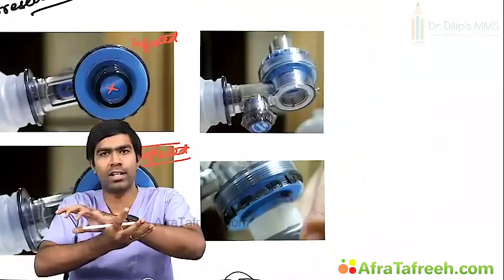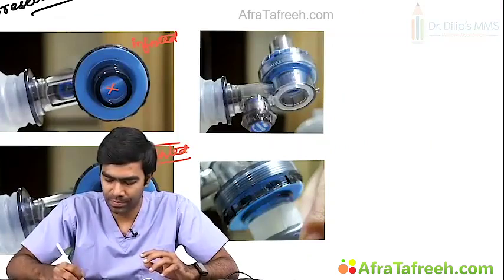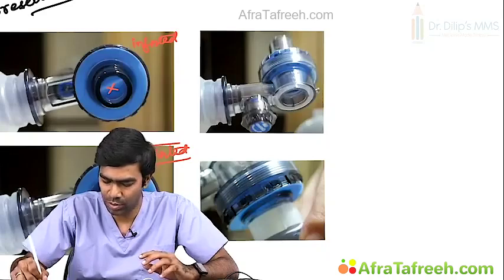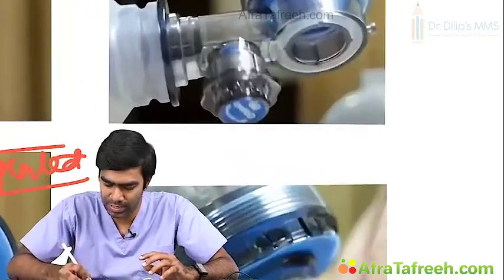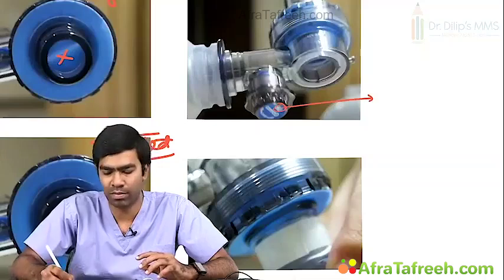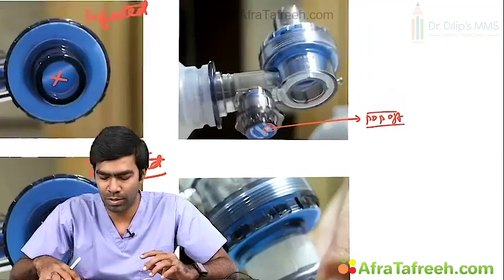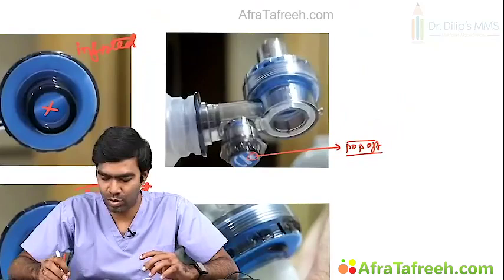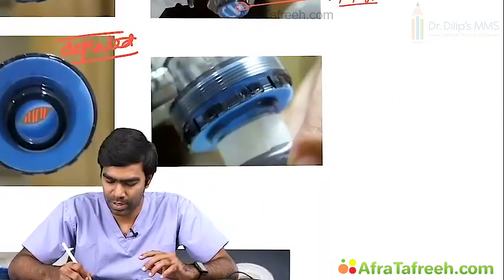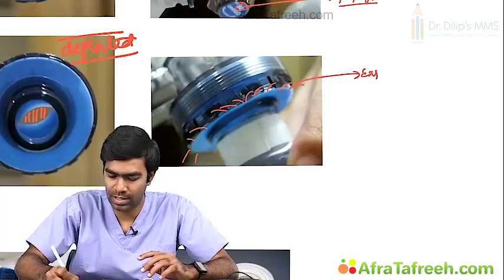And turning the outlet area a little and showing how it will look, you can see the pop-off valve. I don't know how much you can notice, but you can see it here. It is mentioned as 60. It's a 60 centimeter pop-off valve, which means when the pressure exceeds 60 centimeters of water, this pop-off valve will open. And you can also note this is the expiratory port. You can see there is a small opening here. So this is an expiratory port from which the gases come out, the exhaled gases. This is the expiratory port for the patient.